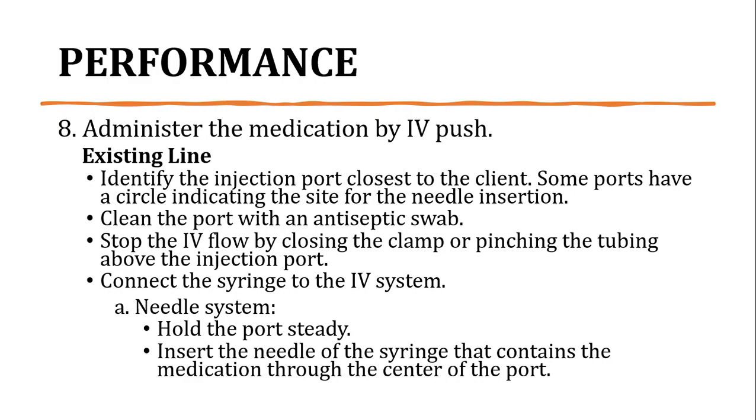Connect the syringe to the IV system. First one is the needle system. Hold the port steady and insert the needle of the syringe that contains the medication through the center of the port. Ito pong center of the port is yung kailangan laging i-insert ng needle of the syringe kapag mag-administer ng medication.